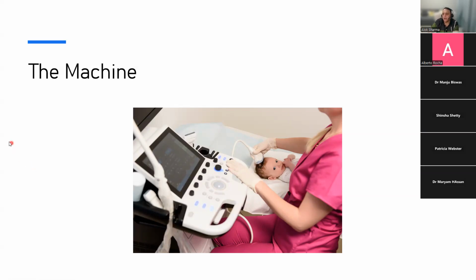And again, I'm just going to annotate. So this is an example of an abdominal curvilinear probe, which usually operates with a frequency of up to about 5. So it's being used in an infant, a baby who's a few months old. And naturally, the lower frequency is being used so that you can get good quality images with adequate penetration, with, I would say, a frequency that will give us acceptable images. We all know that lower frequencies might not give us as good images as higher frequencies. We discussed that in the first lecture.